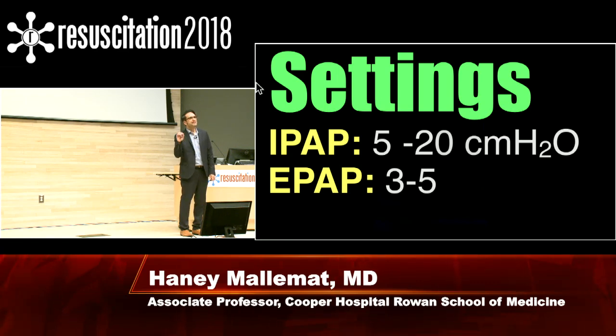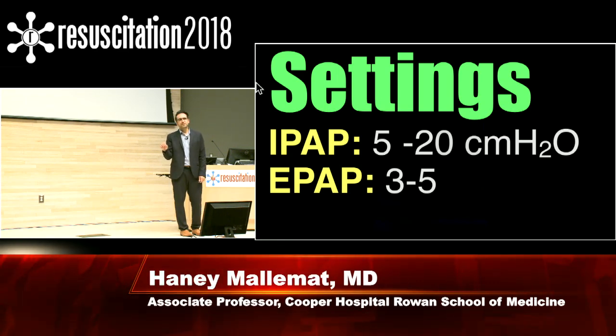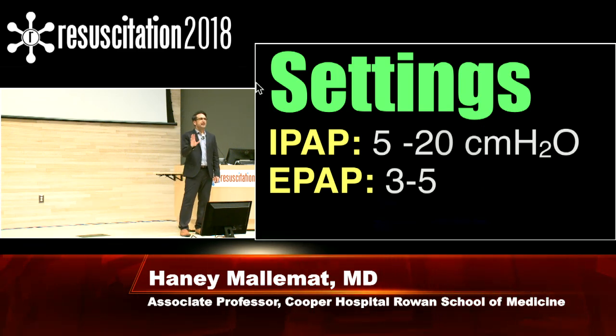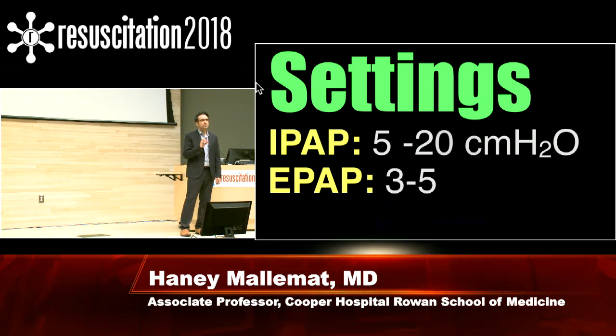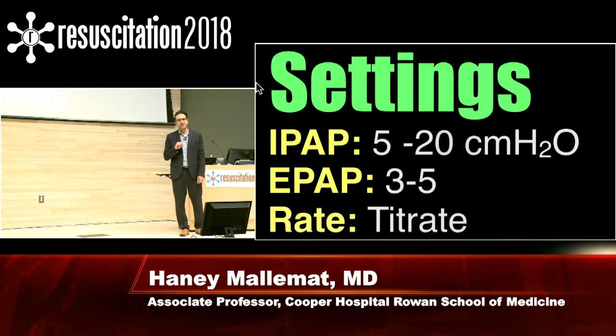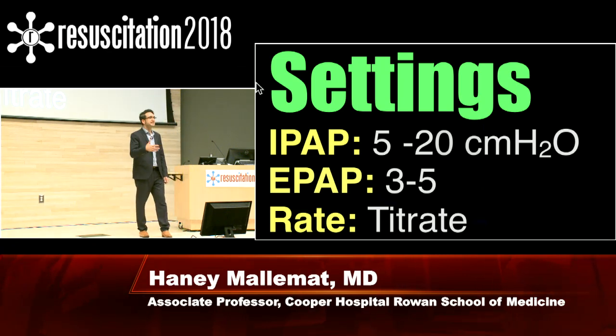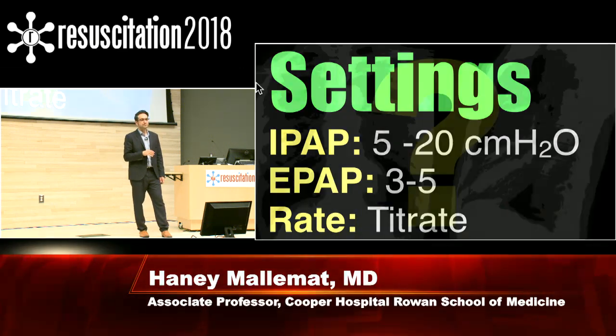Intubated patients are a little bit different. But in a non-invasive patient, you don't have to give them EPAP. Some people will tell you otherwise. Again, I'll leave that to you to decide. But what's most important here is the delta between the two if you want to ventilate their CO2. And again, you can set a rate on some of these machines, but most of these patients are already going to be tachypneic on their own. You don't have to set their rates higher than their intrinsic. They're already breathing fast on their own.